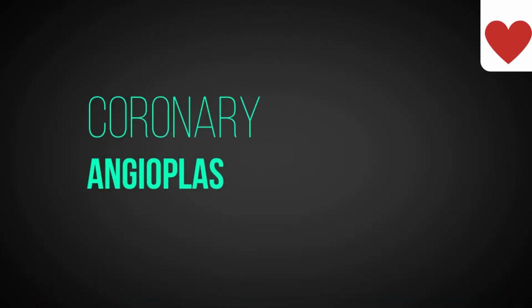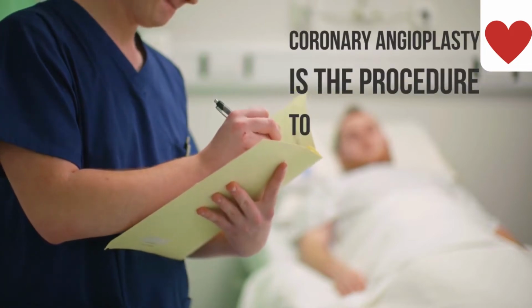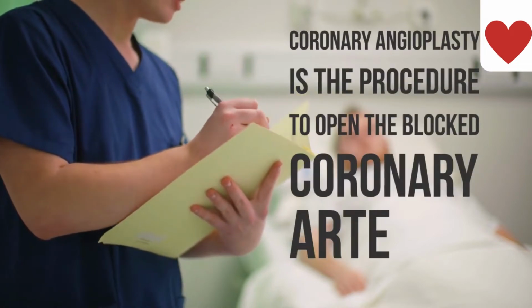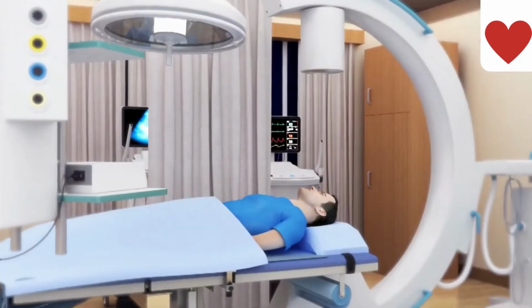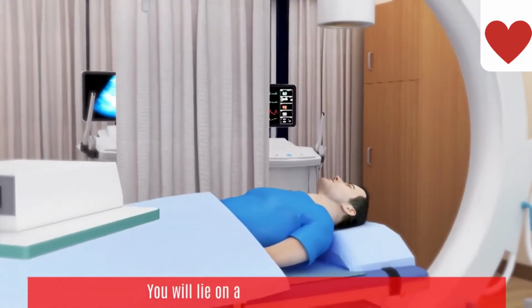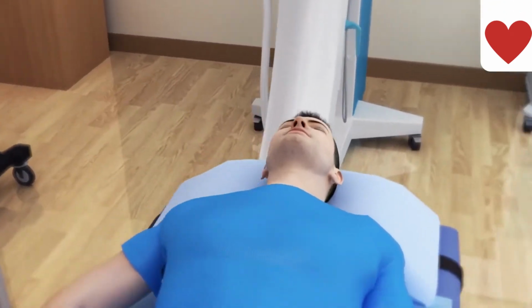Coronary Angioplasty. Coronary angioplasty is the procedure to open the blocked coronary arteries. You will lie on a table in a special room. You will remain awake throughout the procedure.